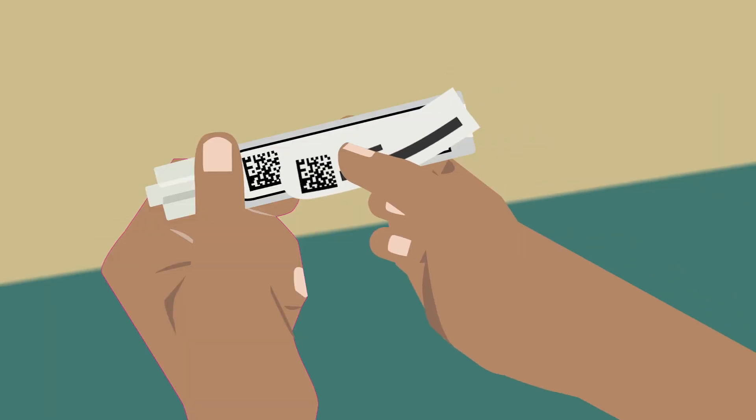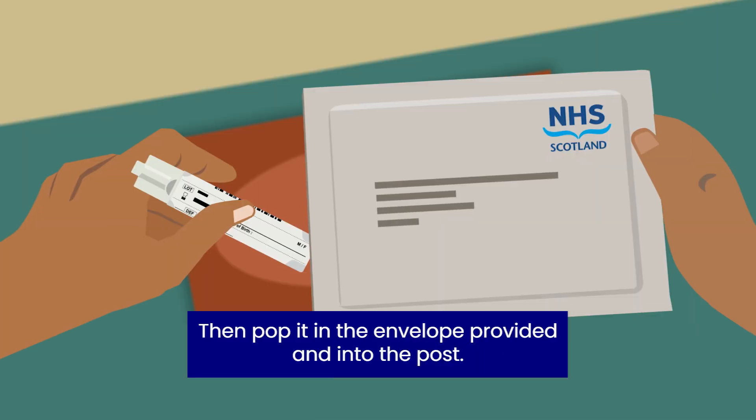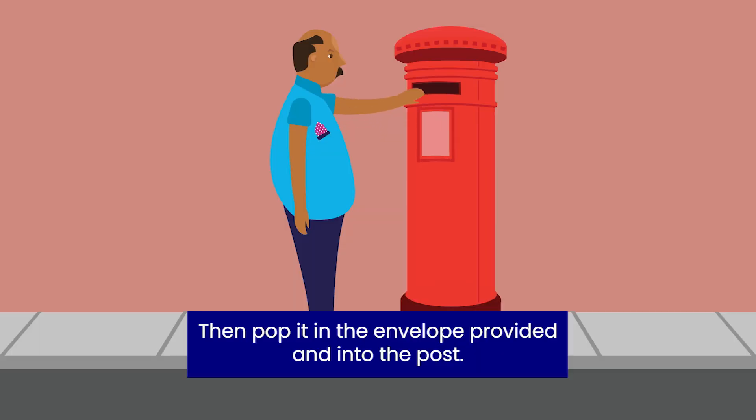Clean and simple. Make sure you've put the sticker on the tube and written the date on it. Then pop it in the envelope provided and into the post.